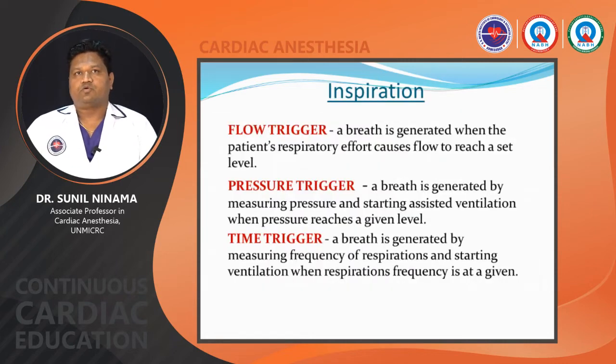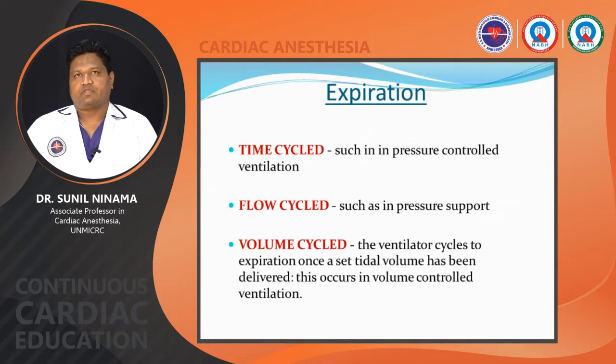Inspiration triggers: you have to set the triggers. There are different triggers: flow trigger, pressure trigger, and time trigger. What do you mean by flow trigger? A breath is generated when the patient's respiratory effort causes flow to reach a set level. With the pressure trigger, a breath is generated by measuring pressure and starting assisted ventilation when the pressure reaches a given level. With the time trigger, a breath is generated by measuring the frequency of respiration and starting ventilation when the respiratory frequency is at a given level. Expiration is again time cycled, flow cycled, or volume cycled.